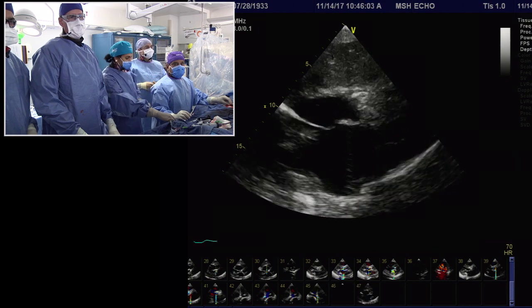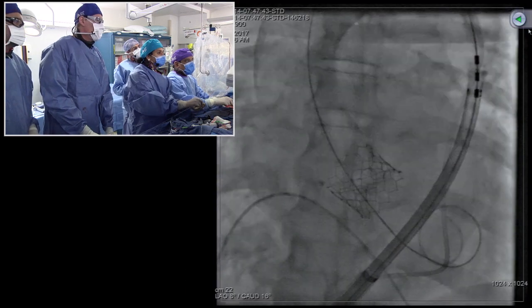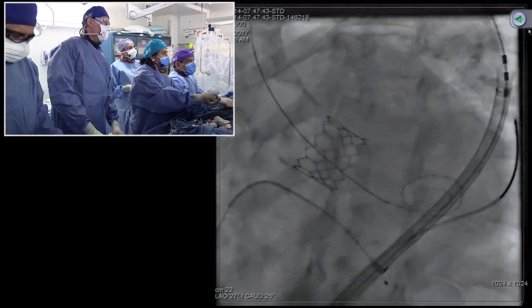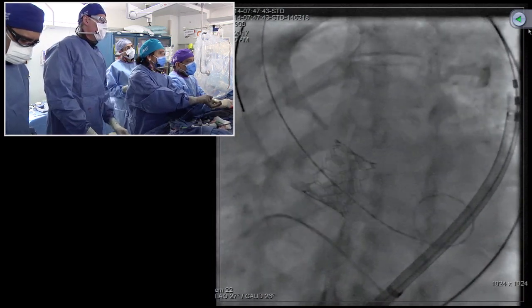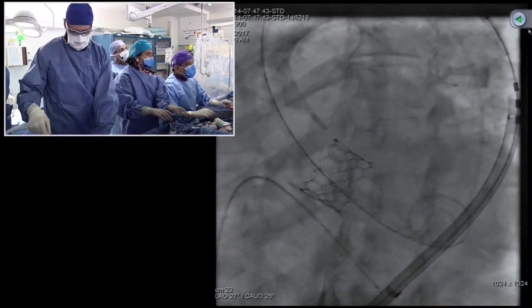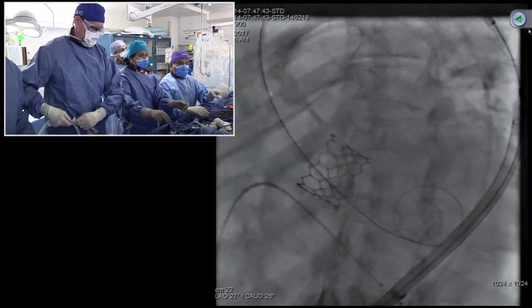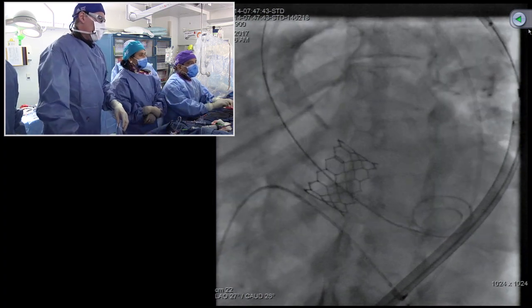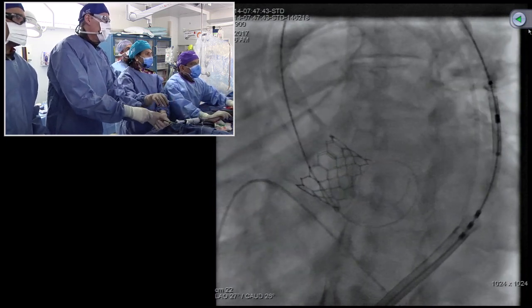Okay, nice. Excellent. So a minimal transthoracic echo approach, not so much invasiveness. That's really good. You can see the final result, a very good projection, relatively. I think we should be doing less manipulation on the aorta. Oh, it went into the LV. Very good. Let's do a pullback gradient there. It's already in the LV. Rather than putting another catheter, we'll just do this. Just do a pullback gradient and remove the other one. Remove the wire though. Confida wire only for the time being.